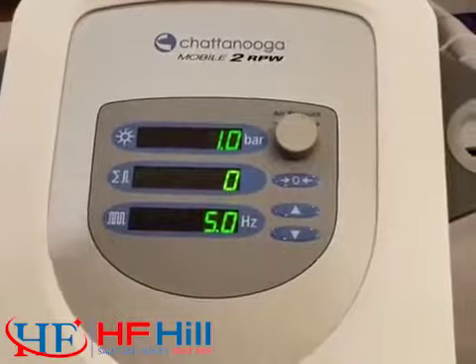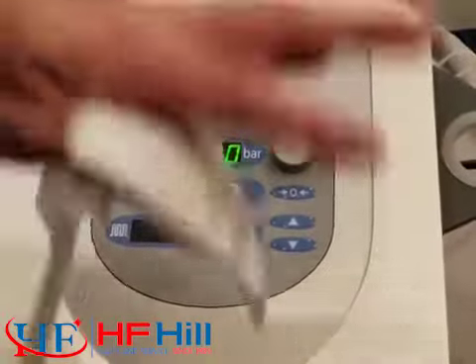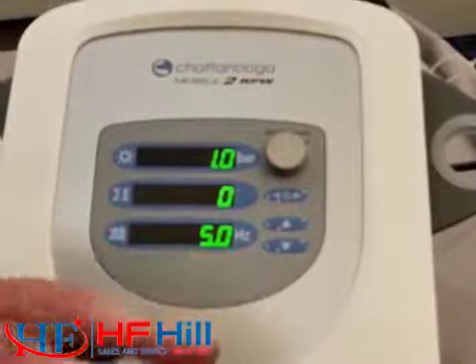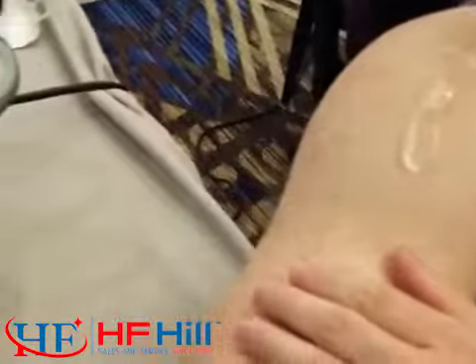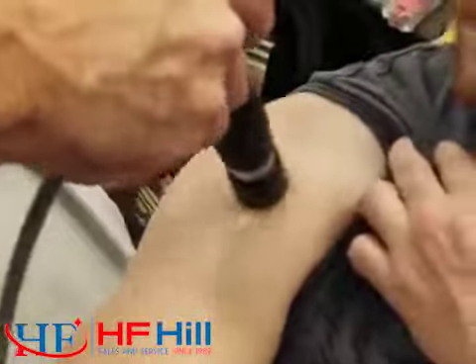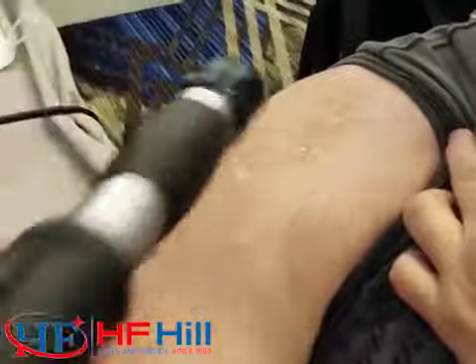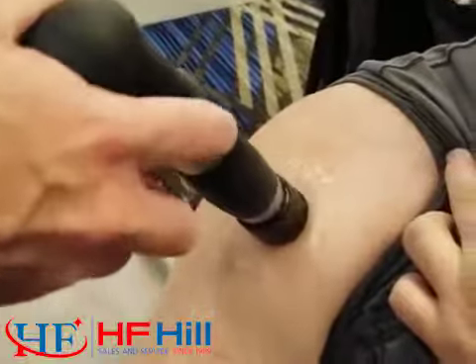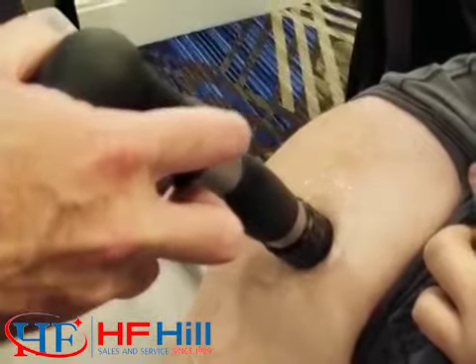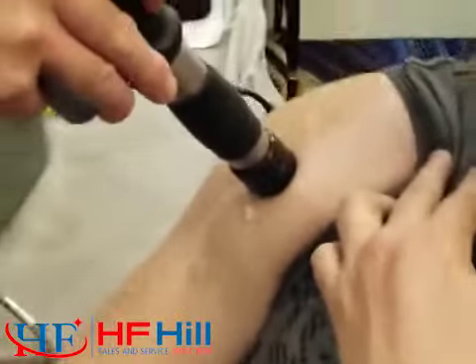In general, we do have some guidelines for this, but what we're looking for from a patient response is a level of discomfort that someone can sustain for a period of time. Even if you had to pull off, all it means is it's not going to translate the energy into the tissue. It's not a moving technique.